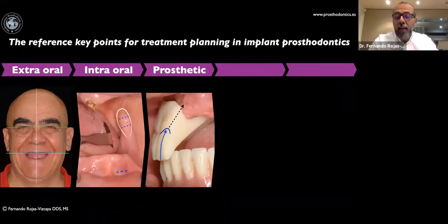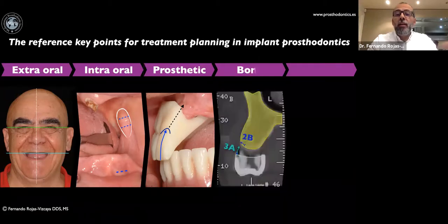for the patient, and make the analysis between the margin of each implant crown and the level of the existing bone. And when I make this analysis, I will know what happened. Now the bone is important, because now I have the teeth.